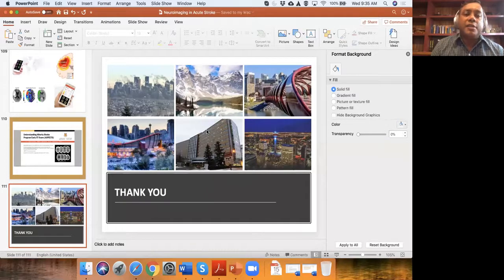If you have a huge extent of thrombus, so let's say you have an ICA occlusion that extends into the M1 and into the M2, that's a big clot. The likelihood that this clot would open up with TPA is going to be low. And so you will clearly need endovascular thrombectomy with those patients.